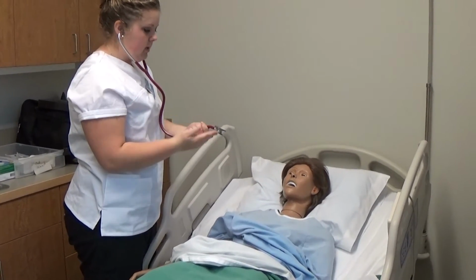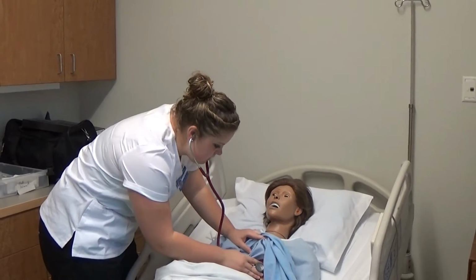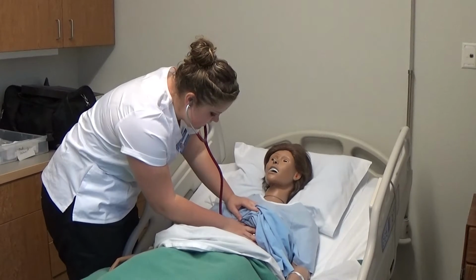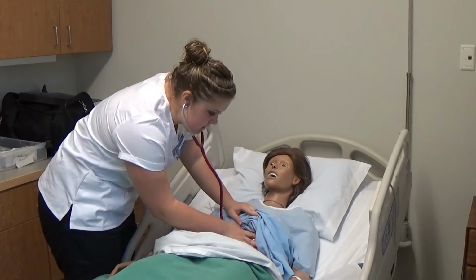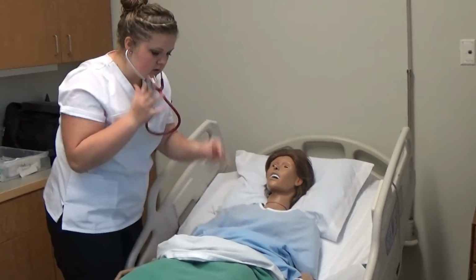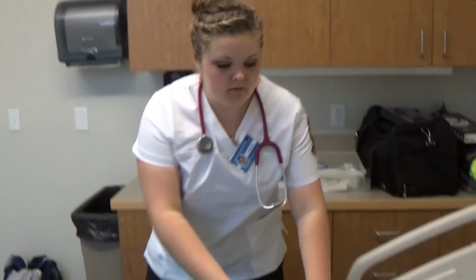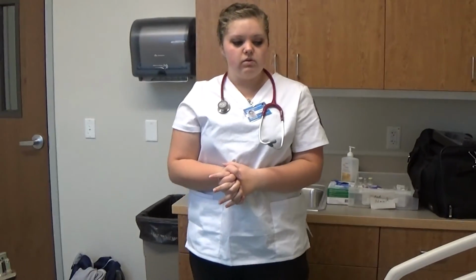All right, so I would take this, and then I would find the 5th intercostal space, mid-clavicular line. Listen to her apical pulse, and I would do so for a full minute to verify that I have the correct heartbeat and everything. All right, and at that point I would administer all of her medications that were pertinent at this time and make sure that she was doing okay.